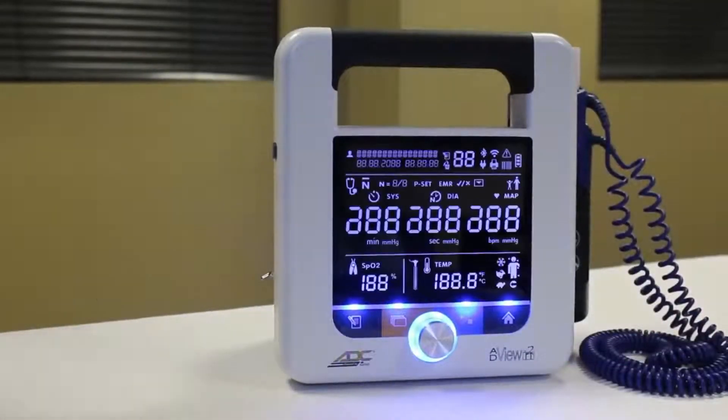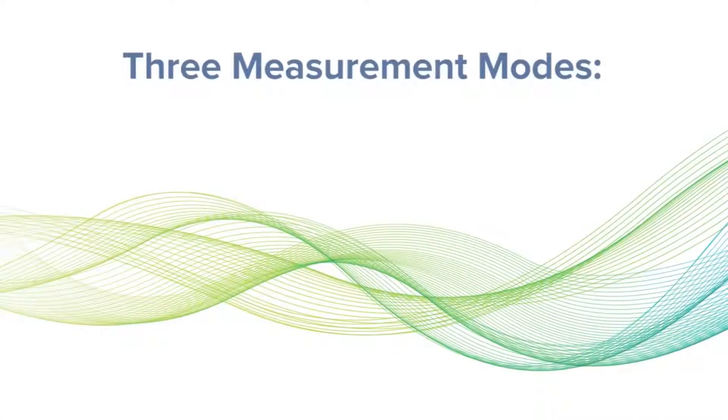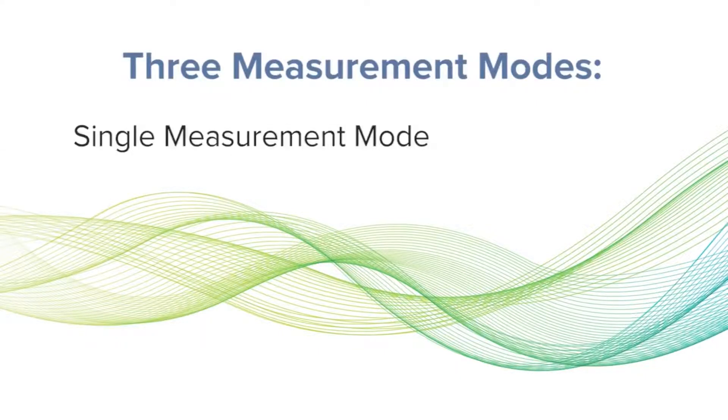If needed, turn the device on by pressing the power button on the left side. The AddView2 offers three different blood pressure modes: single measurement mode, average mode, and manual mode.